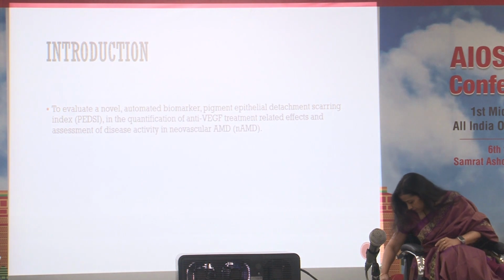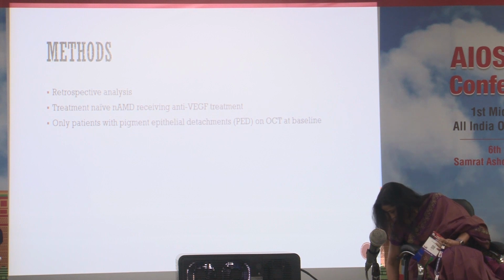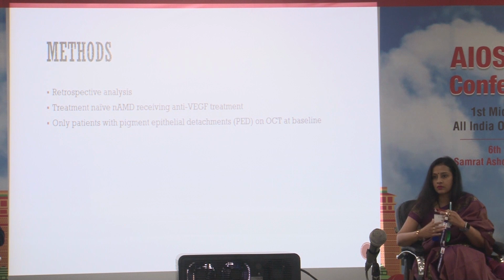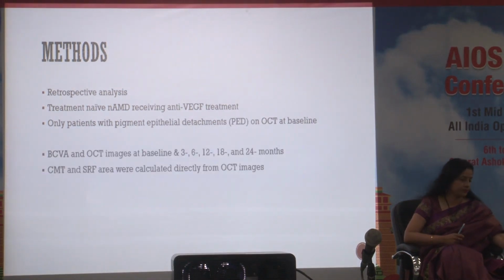The aim of the present study was to evaluate a novel automated biomarker, PEDSI, in the quantification of anti-VEGF related treatment effects and its assessment of disease activity in neovascular AMD. This was a retrospective analysis, and we included treatment naive neovascular AMD eyes which received anti-VEGF treatment and considered only patients who had PED at baseline on the OCT.